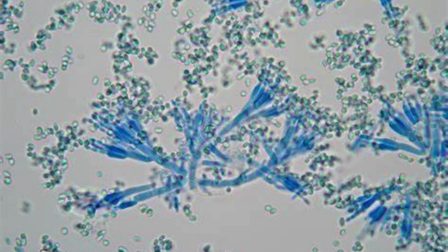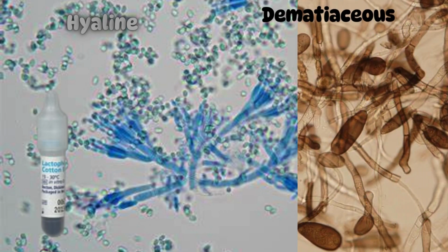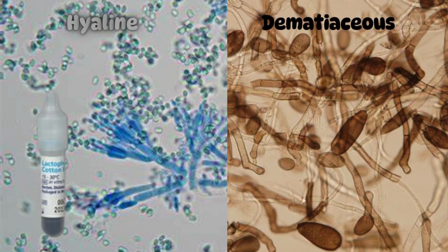Hyaline molds are those that lack pigment in their structures. This means they have clear or colorless hyphae, conidiophores and conidia in nature. On the microscope, they often appear blue due to a common dye, lactophenol cotton blue. This image on the right is of a dematiaceous fungus. These have a tan, olive, or brown pigment in the hyphae, and typically in the colonies as well.